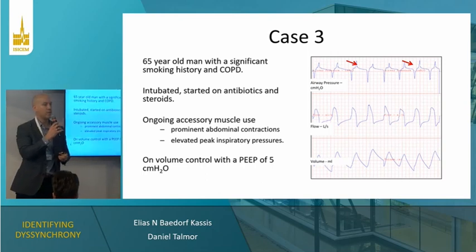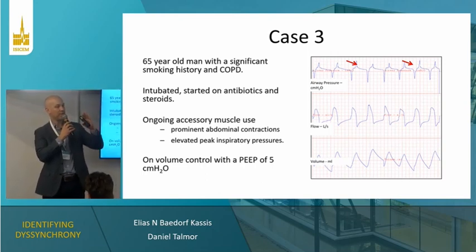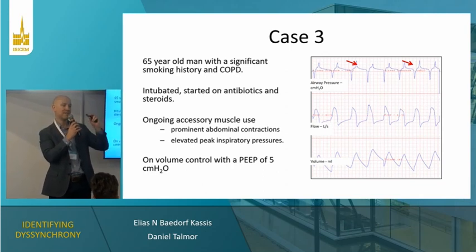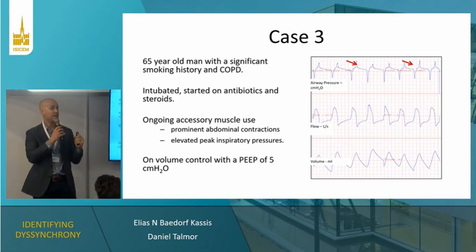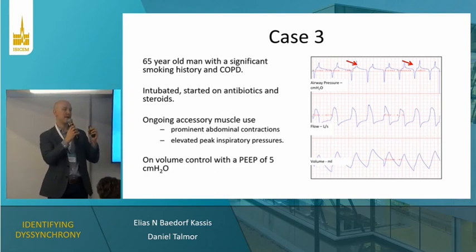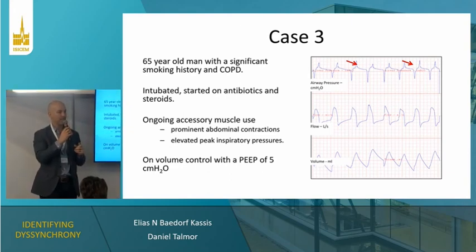It's not going to overshoot beyond what the total pressure is. You may see a little bit of a pressure like that, but if you're seeing a pressure that's significantly higher than the total pressure being applied by the ventilator, then you would not expect to see a very, very high pressure. But you're right, in some cases you may see that sort of relaxation phase too, causing a little bit.